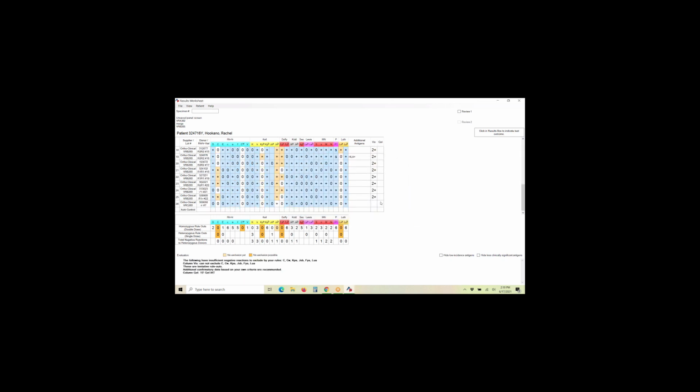Now that we have that there, we can go ahead and put in our cell that's negative here and also our auto control. Whoops, let's take that out. There's no check cell. And now that got rid of our JSB problem. We have one exclusion here, and it was excluded right here. The rule comes up when you hover over it. And now you can see that improved our coloring up here too.